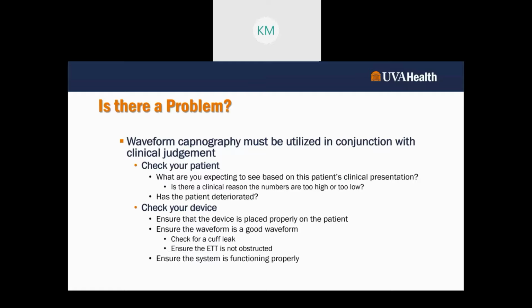All right. You look at your SpO2, you look at your blood pressure, and what we do with those numbers is that we trend them, right? Those numbers over a period of time, whether it's your couple-minute transport, your couple-hour transport, or maybe your 12-hour shift, they're all painting a picture for you on how your patient is doing. You can trend those numbers and see the direction in which your patient is heading. Yeah, my blood pressure is getting a little bit low, and a little bit lower, and a little bit lower. And over a period of time, at some point, a red flag hopefully will pop up: my patient's blood pressure is going down. Same thing here. Use it as a tool.